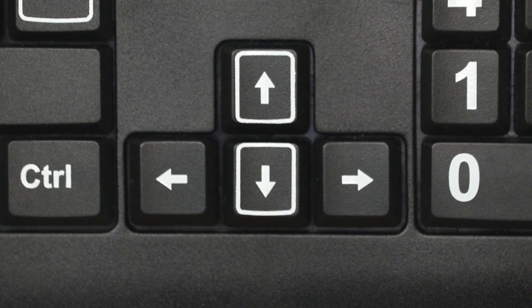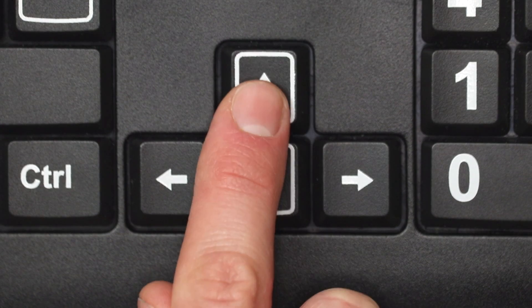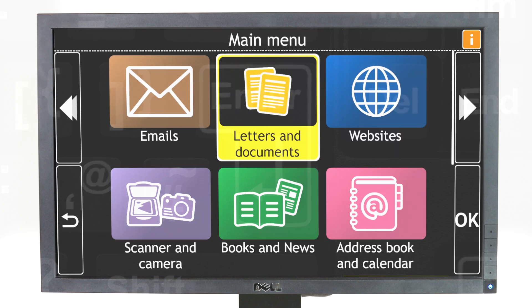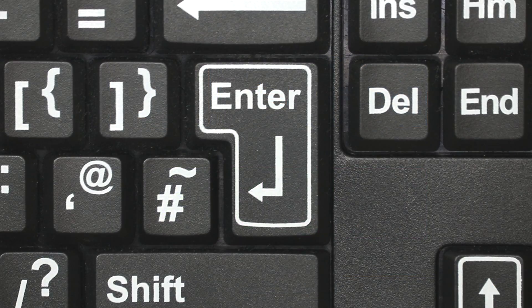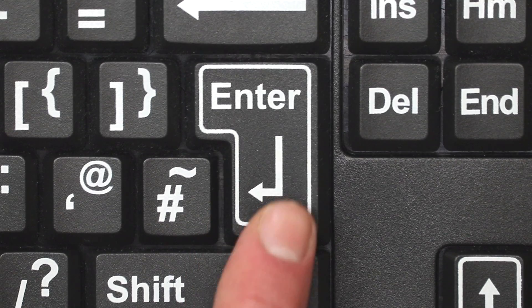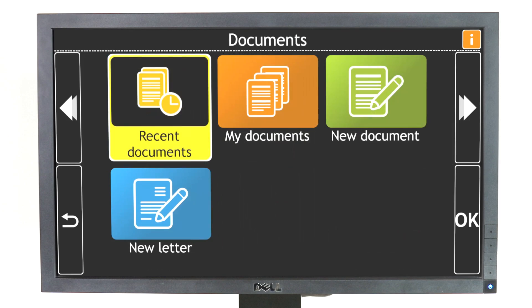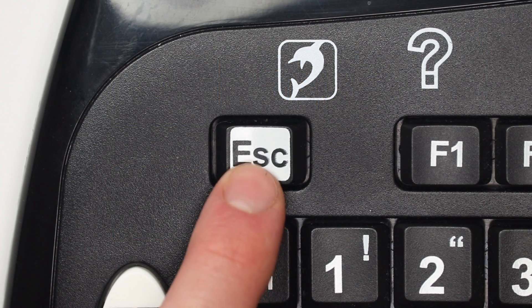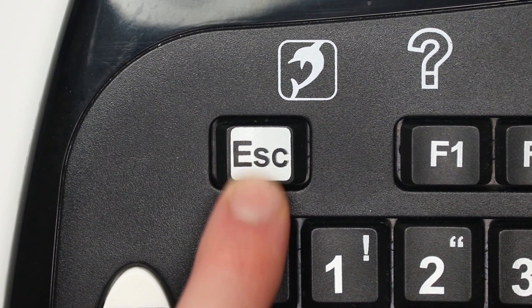The up arrow moves you to the previous item on the screen. Enter selects your item and opens a new screen. And Escape takes you back to the previous screen.